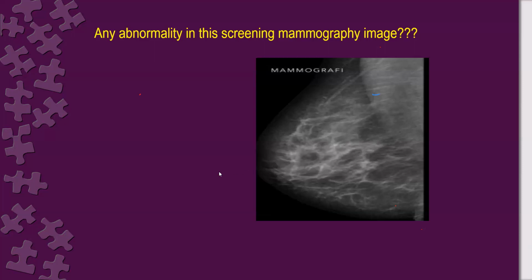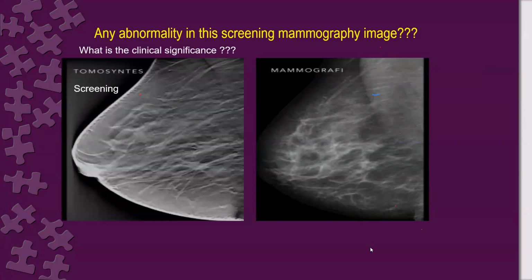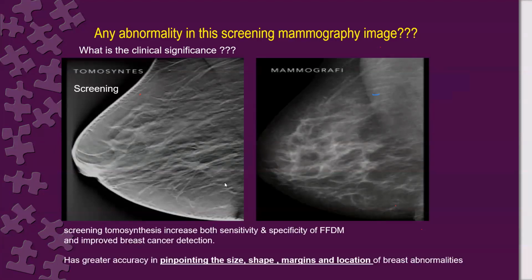Let me show you the tomosynthesis. Can you see the lesion here? Yeah, it is. This is the location. Even in retrospect, it's really difficult to see this spiculated mass with long spicules and surrounding architectural distortions. You see, and even here there is some traction.